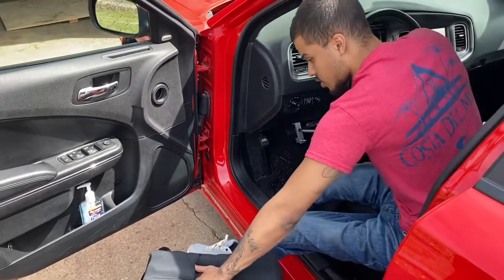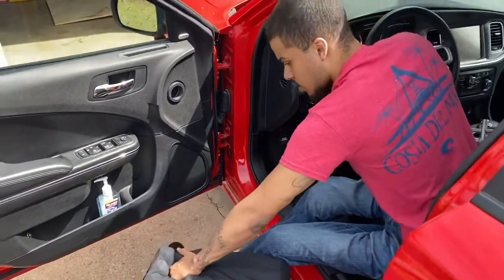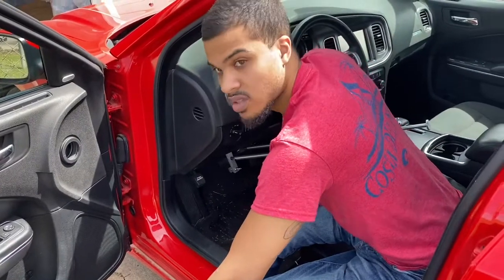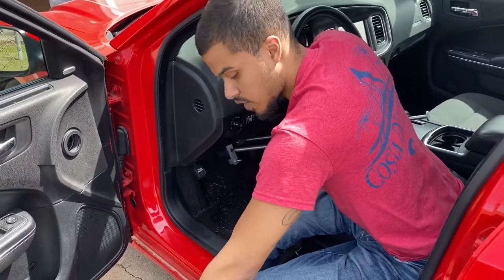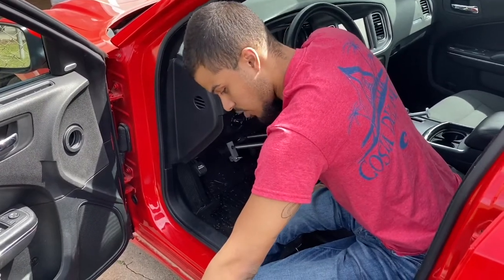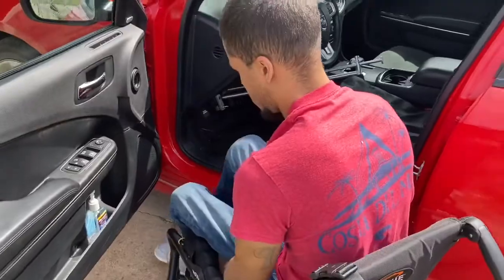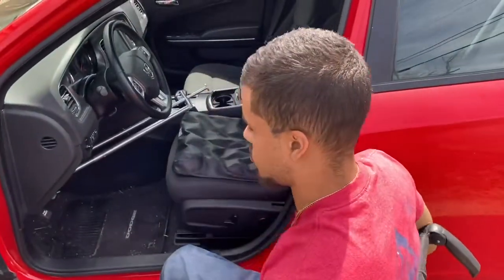Scoot over slowly until your feet kind of fall in place. Give yourself like a count of three and then throw yourself back over. Don't be scared to do it — it's no different than transferring anywhere else, just a little bit more space. But once you're scooted up to the edge of the seat, you really don't have anything to worry about. One, two, three. Get your legs back on, straighten yourself up, and you're good to go.